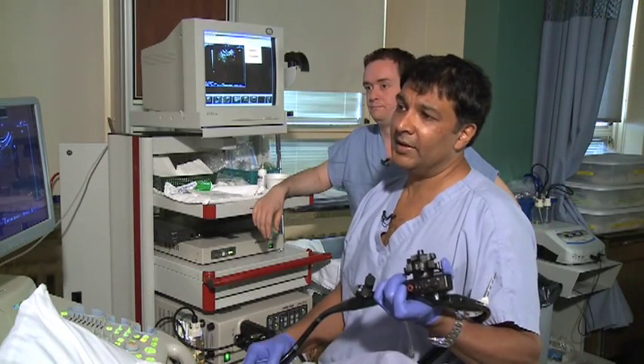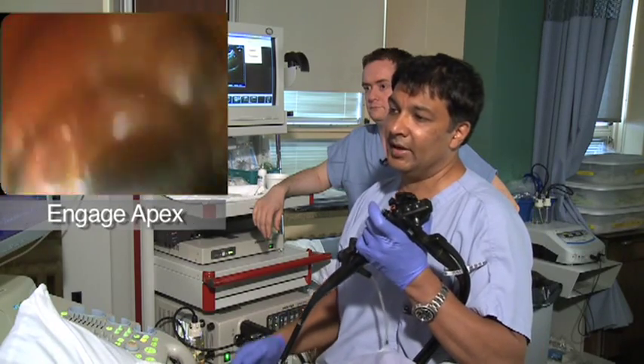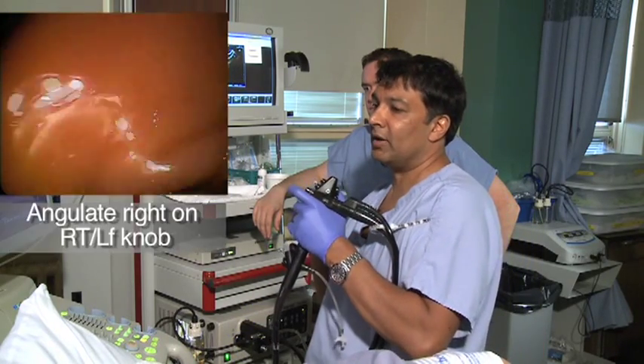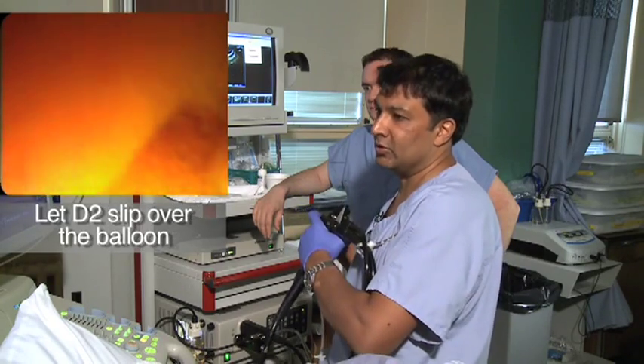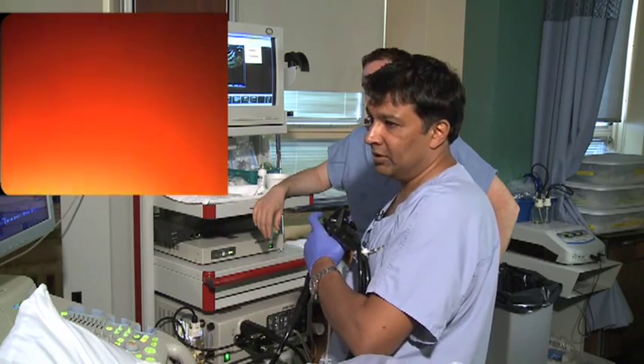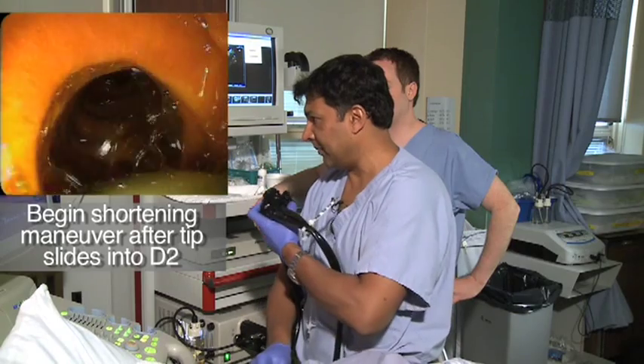To go into the second duodenum, we leave the balloon up quite large, just kind of engage into the apex, and then torque — give it some right on your right-left, turn your shoulders, and just let the duodenum slide over the scope and come down. Really normal duodenum as well. Then you just shorten up like any ERCP: put your tip max up and come back.